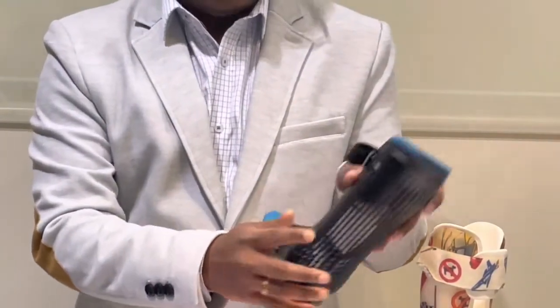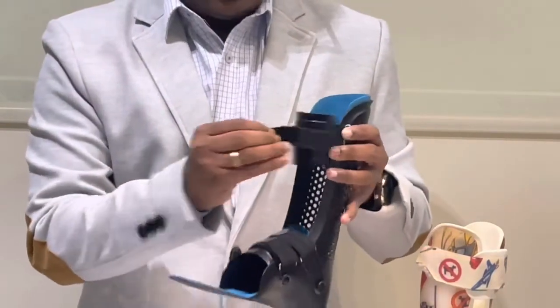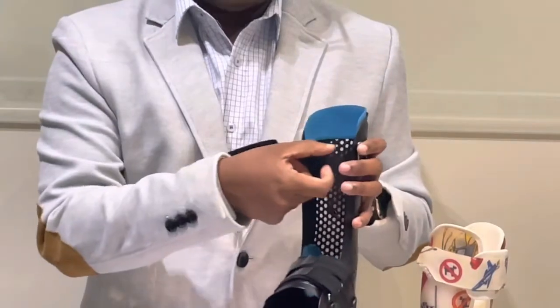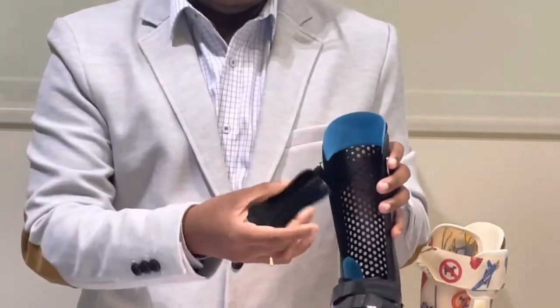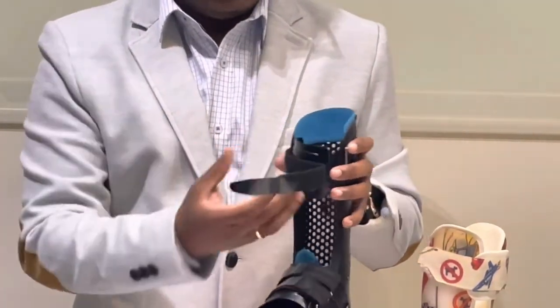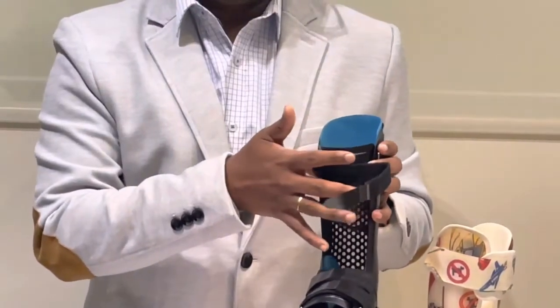Coming to the straps — the straps do not have any bulky buckle, which makes this AFO slimmer and allows parents to fit a normal shoe. For most children using conventional AFOs, the strap markings create redness on the skin. In this 3D printed AFO, there is a very flexible padding that acts like a silicone skin, preventing direct pressure on the skin.